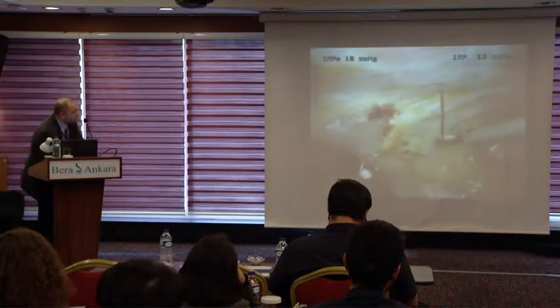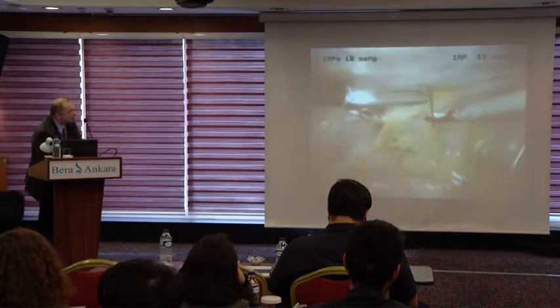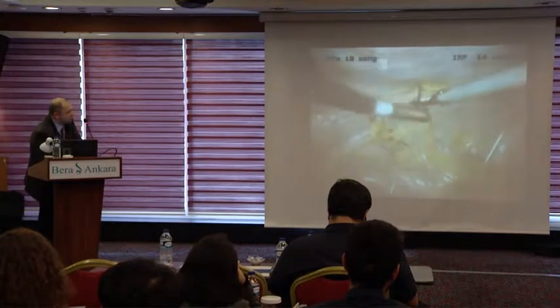The intra-abdominal pressure is 15 millimeters of mercury now. The best pressure is that.